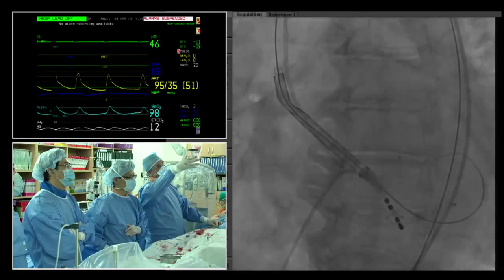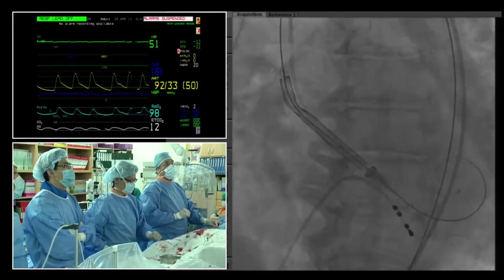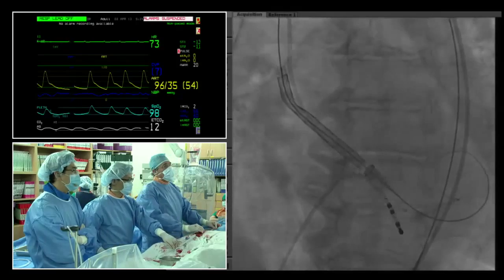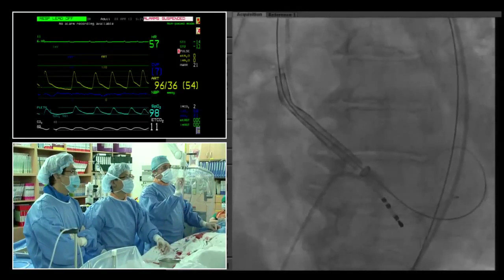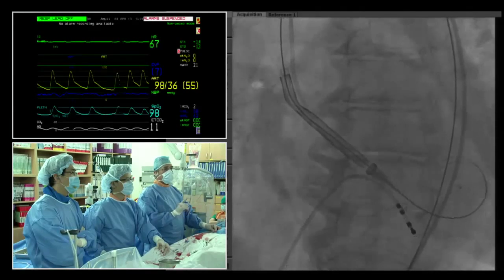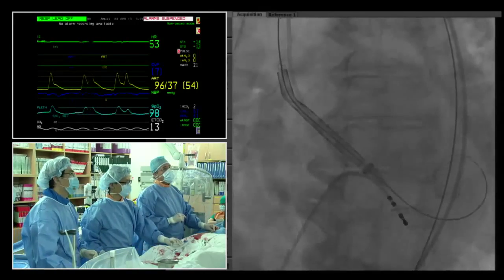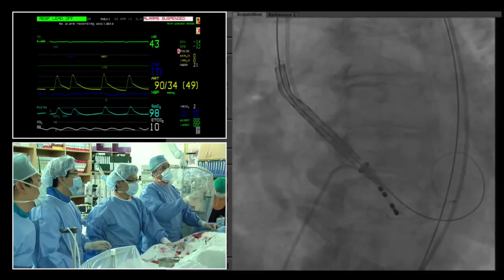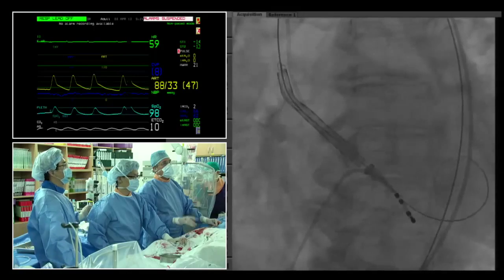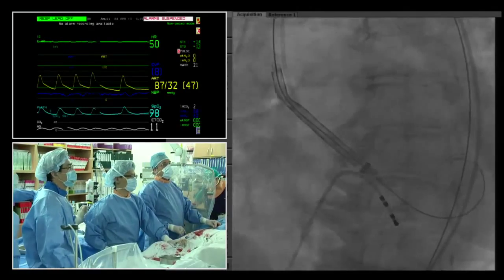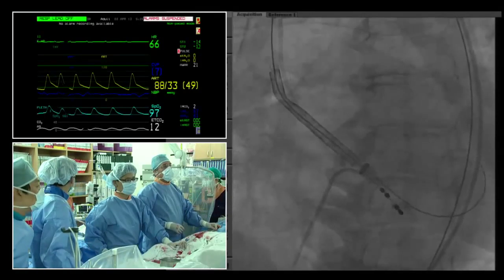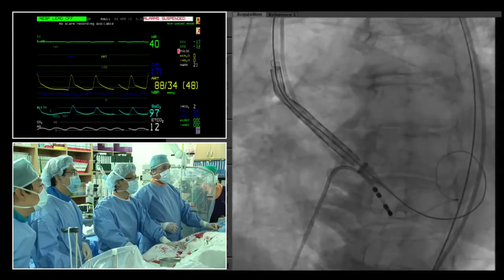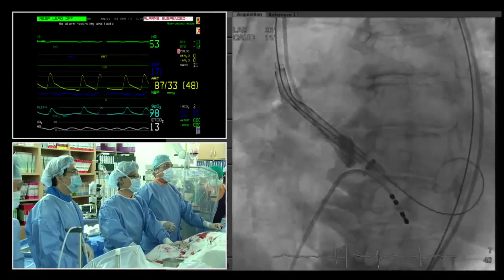The implant direction is set so that the commissure will not be directly in front of the left main, reducing risk if there is any measurement error. The projection is adjusted — going slightly more caudal and then slightly more LAO — to better see the annular ring. An angiogram is performed to reassess anatomy before beginning deployment.